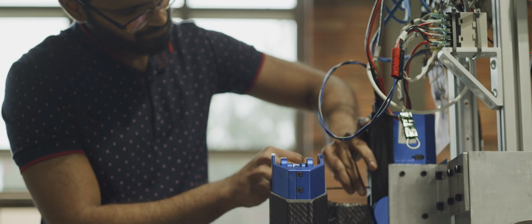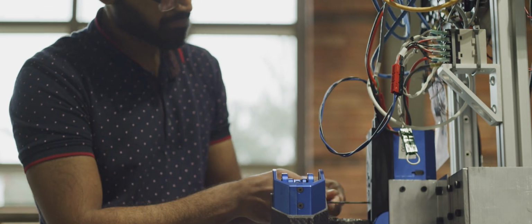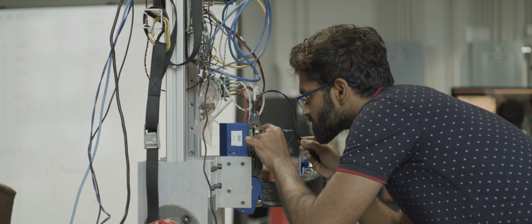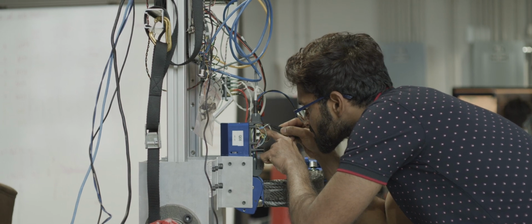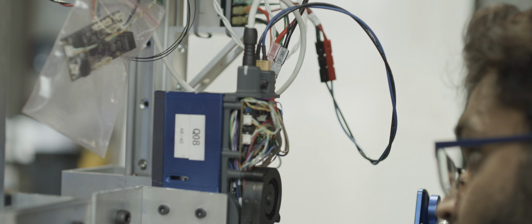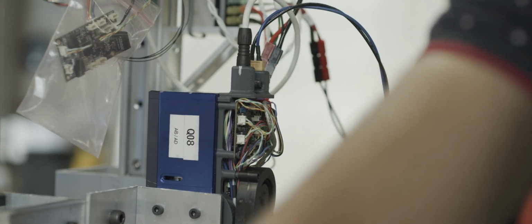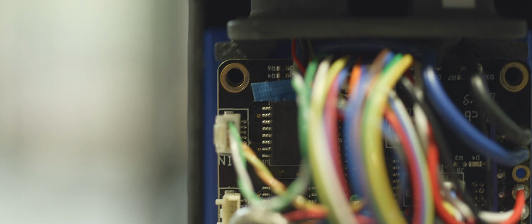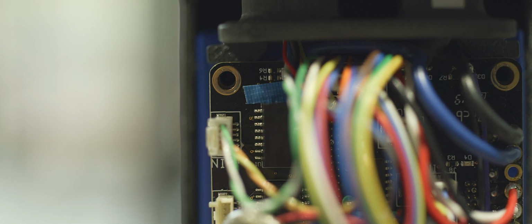So what is that piece of tape? So what happens is that those two LEDs are close to each other. So when the e-stop is turned off, you should be able to see green light. But due to the interference between those two LEDs, we are not able to see a clear green light. So that's why we are taping the other LEDs so that we can make sure that the e-stop is on or off.